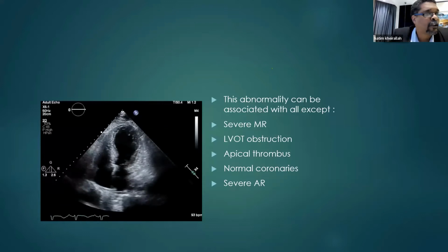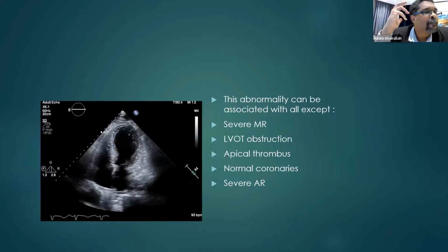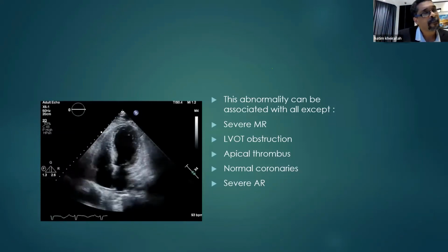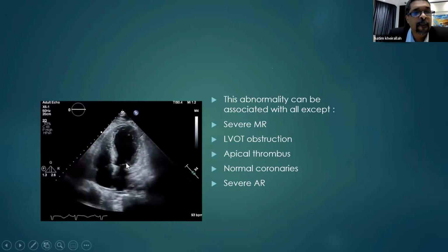I asked him to send me the videos and I was astonished to see a gross abnormality that might be the reason for the dynamic crashes, which was completely missed by the fellow, simply because of the so-called satisficing, premature closure, anchoring bias. His mind was set on excluding MR and VSR. It was complete LVOT obstruction by SAM.